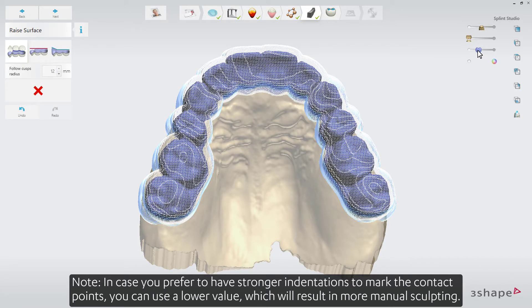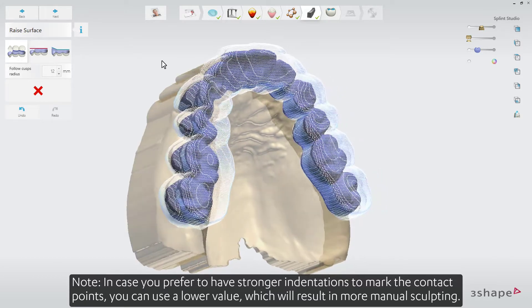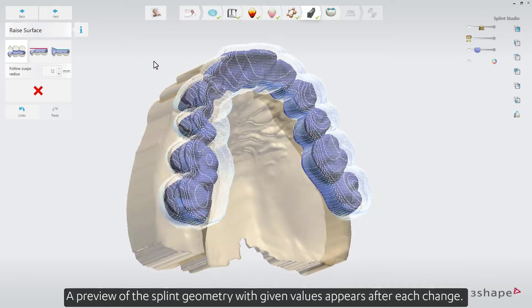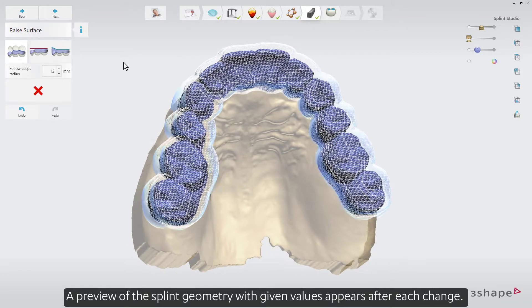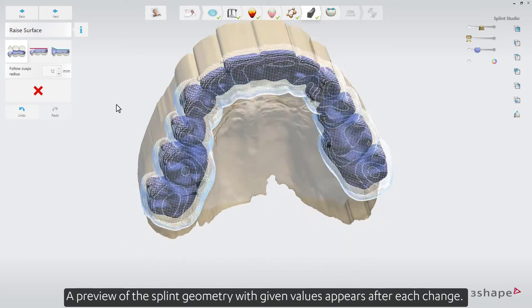Note: in case you prefer to have stronger indentations to mark the contact points, you can use a lower value, which will result in more manual sculpting. A preview of the splint geometry with given values appears after each change.